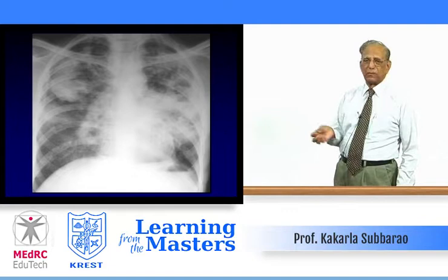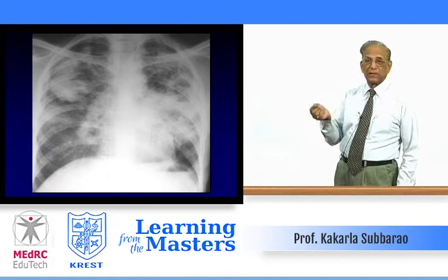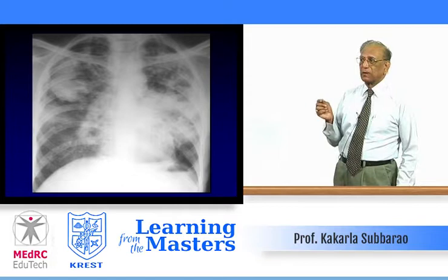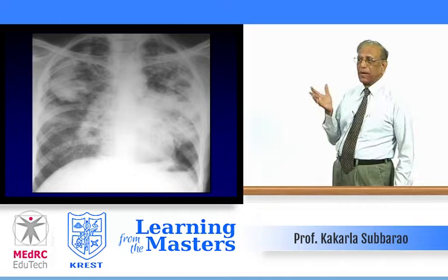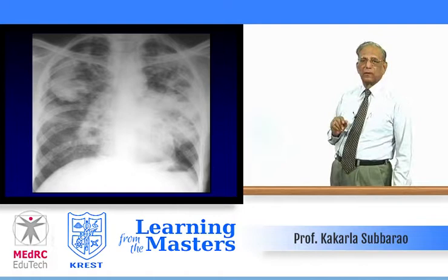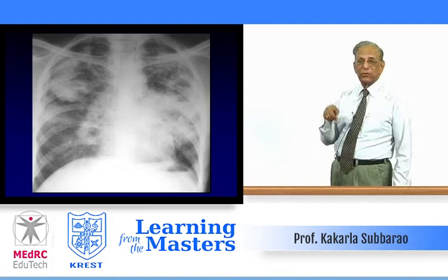The heart is normal. About the hilum — they are just big. The hilum may be big because of nodes, because of dilated vessels, or because something else is there — a mass in the hilum. There is no bone erosion, no soft tissue changes. Looking at the right upper lobe, there is a homogenous opacity whose outer border is parallel with the thoracic cage — that is a significant finding.